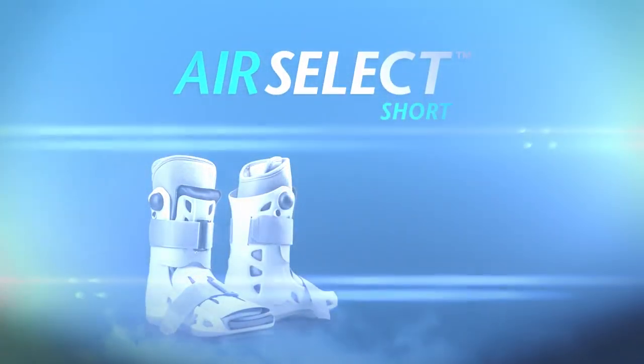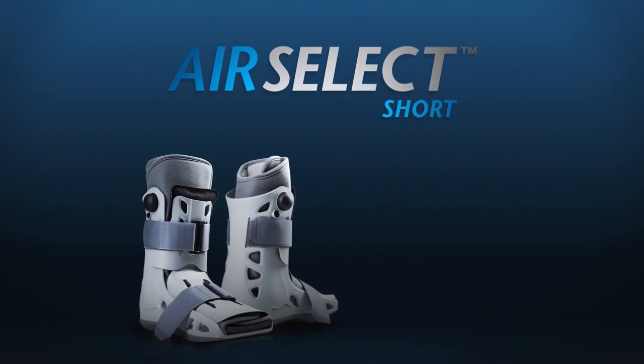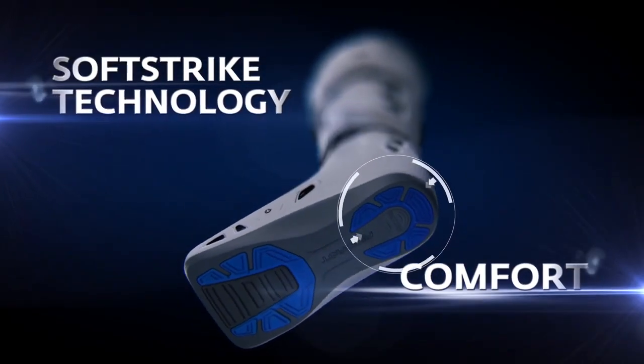The AirCast AirSelect short walking boot puts comfort, control, and healing in the hands of the patient with the most advanced pneumatic walking brace available.